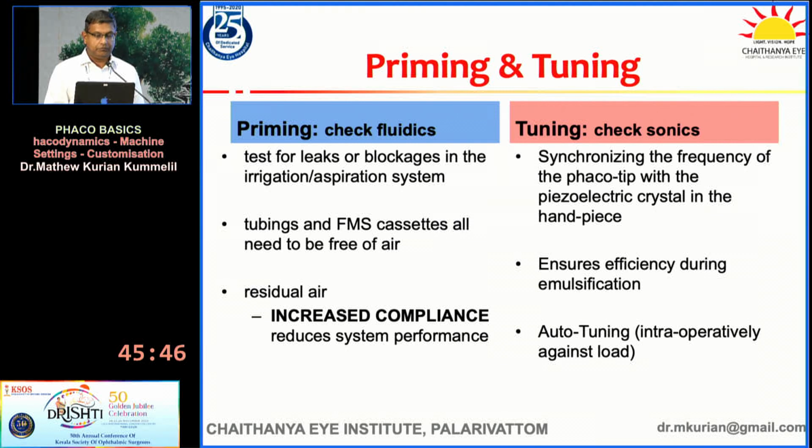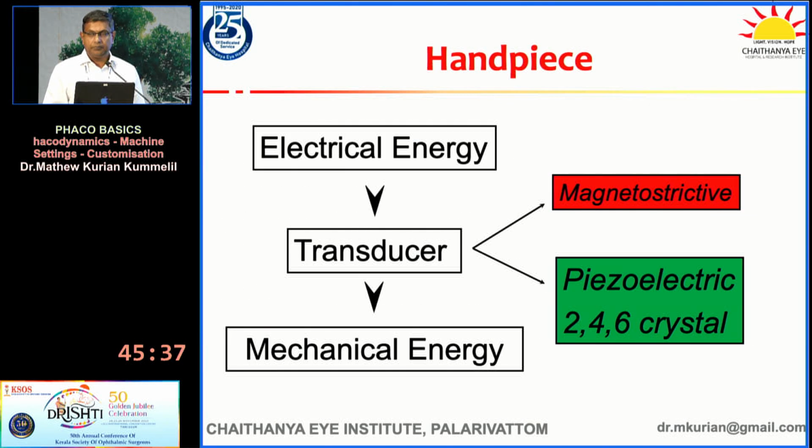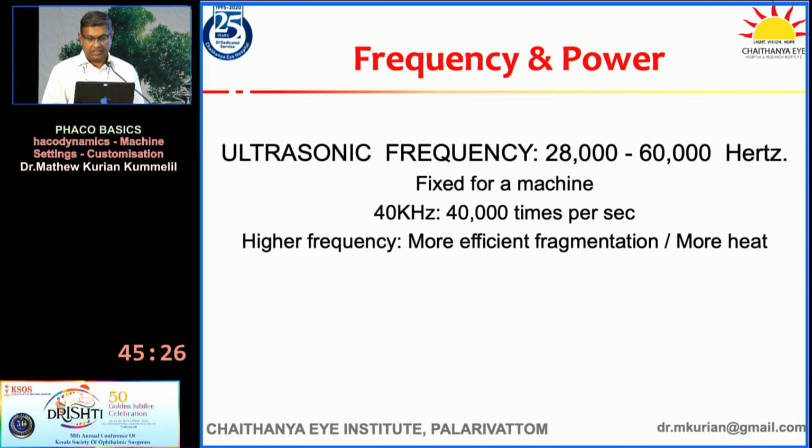The first step, of course, before we start anything is priming and tuning, which often we don't do. The staff will be doing it for us, but we need to understand what they do. Priming is to check the fluidics, and tuning is to check the sonics of the phacotip. The handpiece converts the electrical energy into mechanical energy, and today almost exclusively we have piezoelectric crystals in the handpiece. 4 or 6 is a current standard.